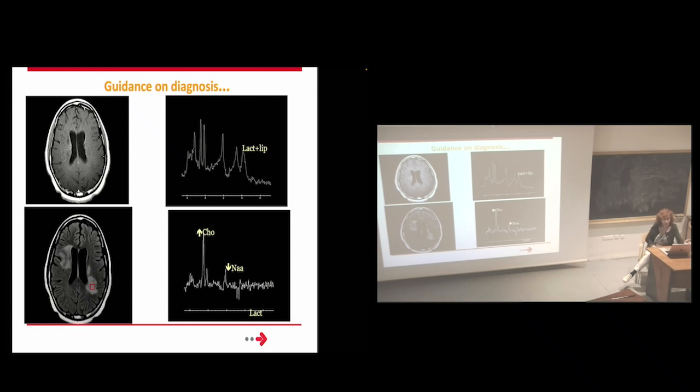So here you have, for example, some imaging. On the top of the slide, you have a normal brain. And you can see that you have lactate, for example. I don't speak about lactate, but lactate is also another indication for good behavior of the brain or other organs, of the kidney, for example. So here you can see at the right of the signal a peak of lactate that corresponds to a normal behavior.